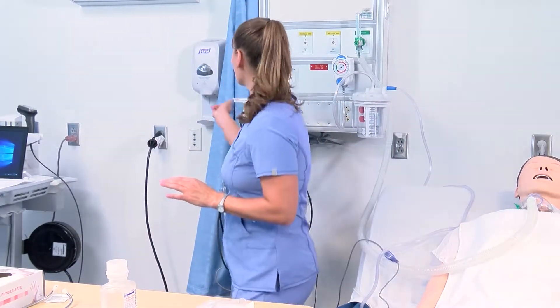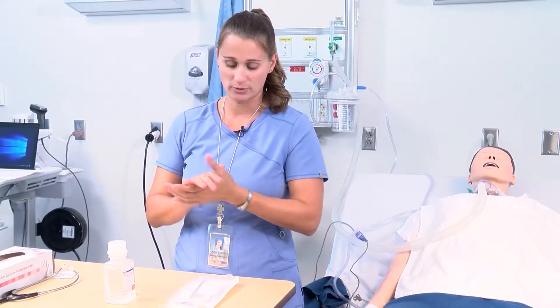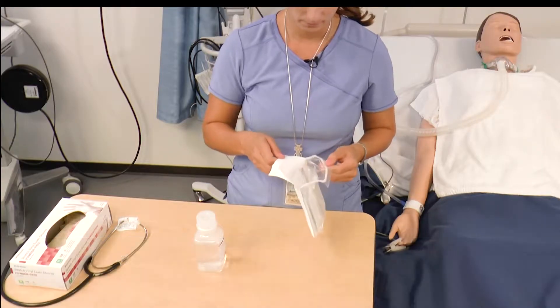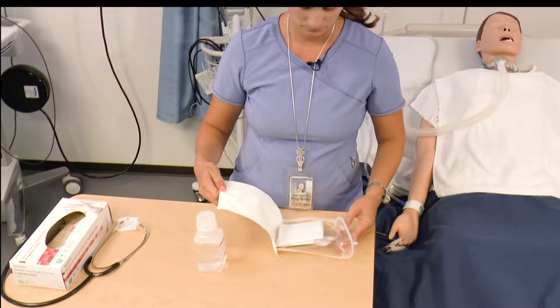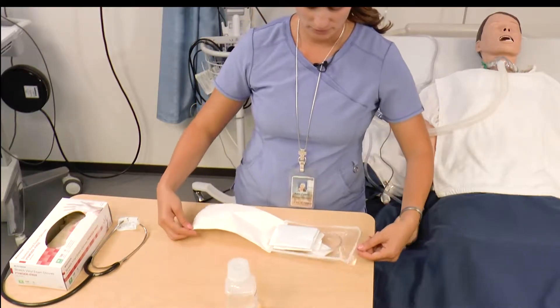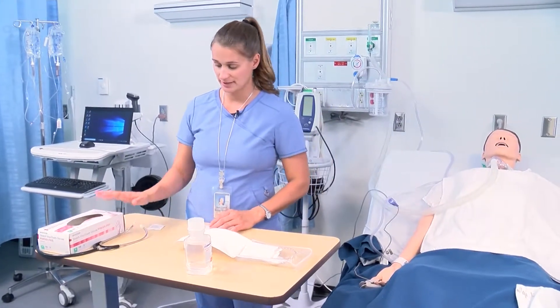After I have washed my hands again, I will be opening my kit, making sure the expiration date is noted and that the packaging is intact and not soiled. Once I open my kit, you'll see that I have gloves on top which I'm going to remove, but everything in this kit is sterile — I can't touch it unless I have sterile gloves on.